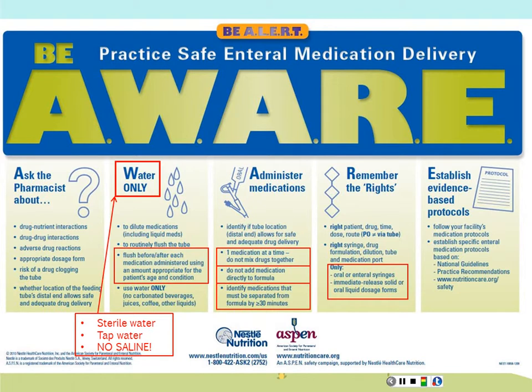If your tube becomes clogged, if it's defective and the end pops off and fluids leak out, you want to know if the patient actually lost a multivitamin, which is not a big deal, or if they lost their seizure med, which could become a problem an hour from now when your patient starts to have seizures on you. So you always want to give only 1 medication at a time.